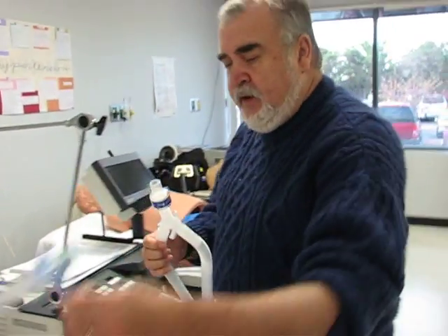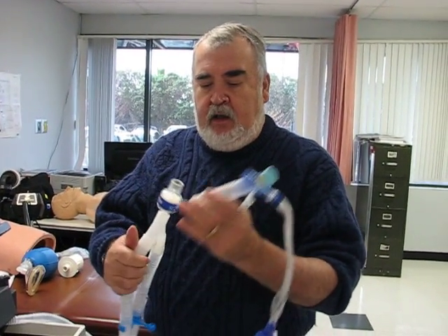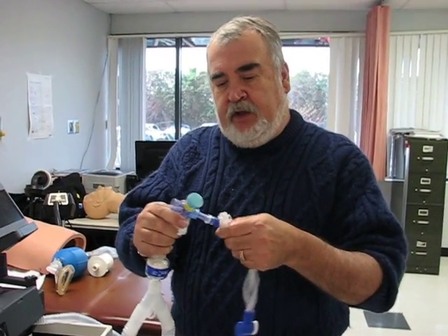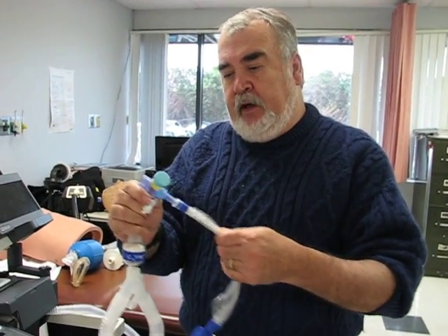Then you take your Ballard assembly — this is for in-line suctioning. This end of the tube goes on here, and that way, when the patient's on the vent, you can suction without breaking the circuit open.